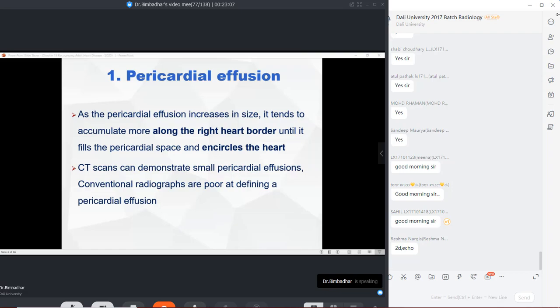Logically speaking, even if I show an amateur, an undergraduate like us, some kind of picture, even without me telling you, you can get an instinctive feeling that something is wrong with that radiograph. But on echocardiography, no, you will not be able to figure it out, even if I give you very detailed information about the echogenicities, how a pericardial effusion looks, how a normal cardiac muscle looks. You will not be able to elaborate that.